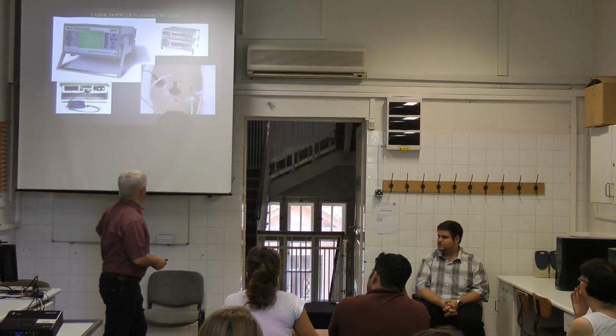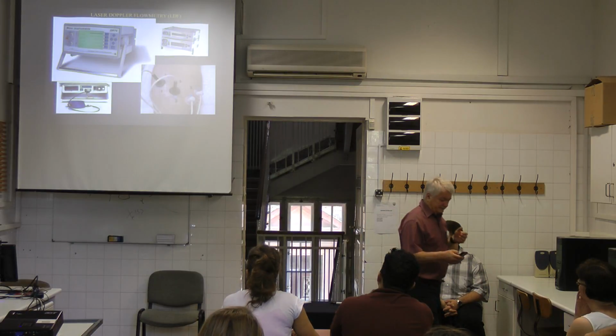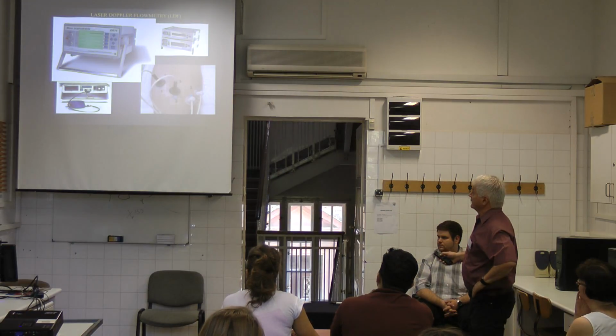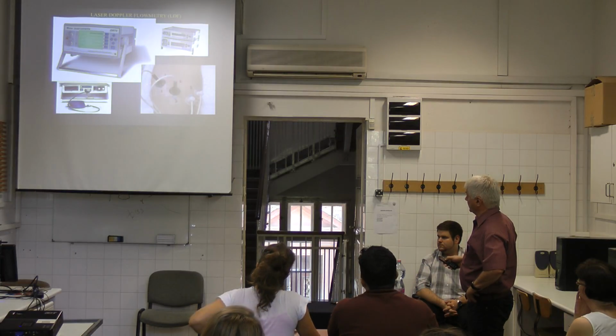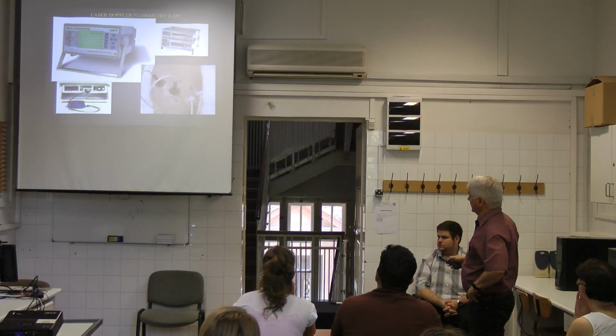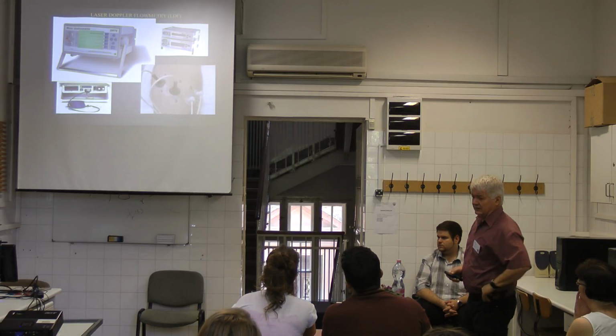So this is how a laser Doppler flow meter looks. This is the monitor, this is the optical wire, and these are the detectors.